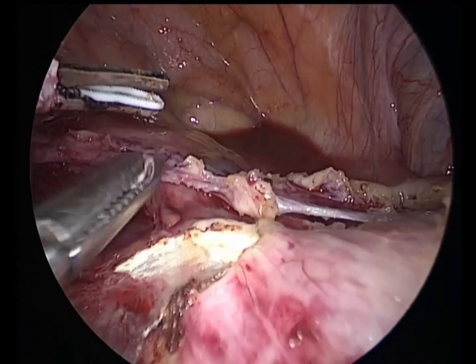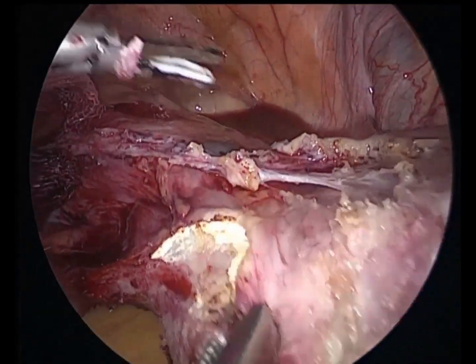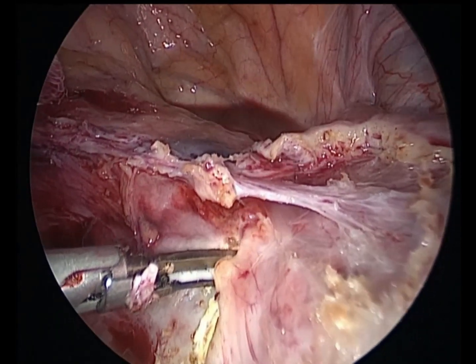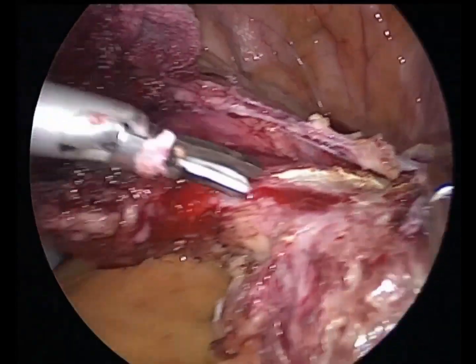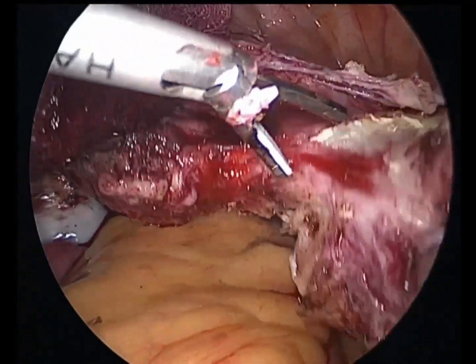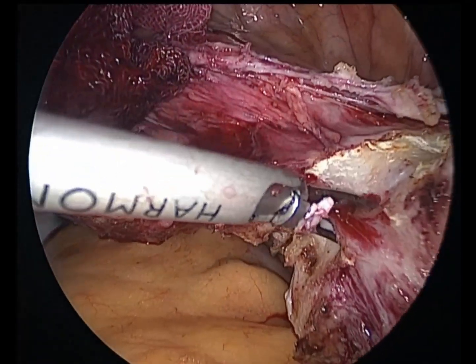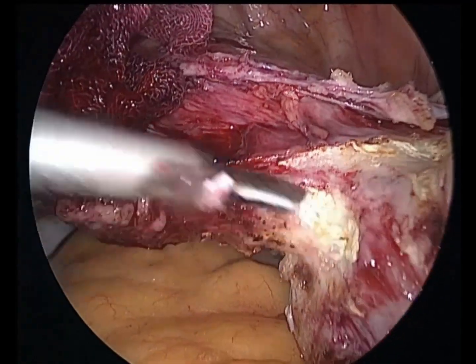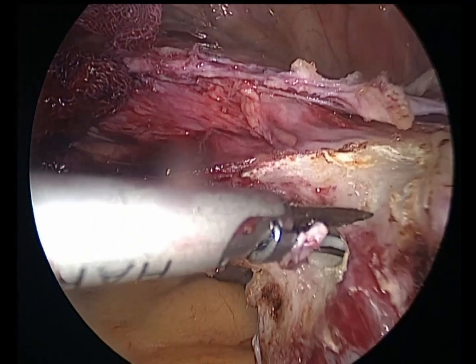The only thing that I have realized is dissect as much from the left side as possible and do the rest of the dissection from the right side. The right side will then take around a few minutes to complete because most of the work you have done from the left side.